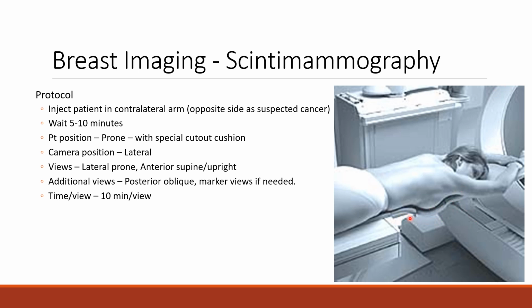I feel like that holder's not great, but sometimes what I have seen other people do is the patient just kind of shimmies up, or they use whatever they use for prone cardiac imaging, or with some of these cameras, you might be able to place their head slightly different, but still have their breasts kind of free hanging. And that creates an even better separation than the holder. But the point is, you want gravity to work with you, so they're prone, and then you want the breast to be able to hang so that they're separated from the chest wall.